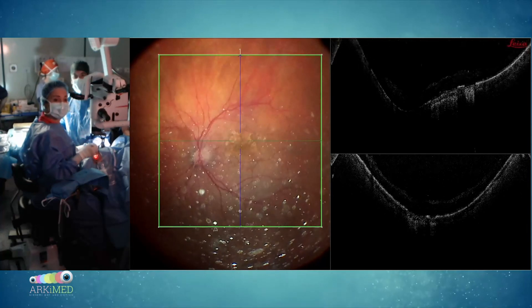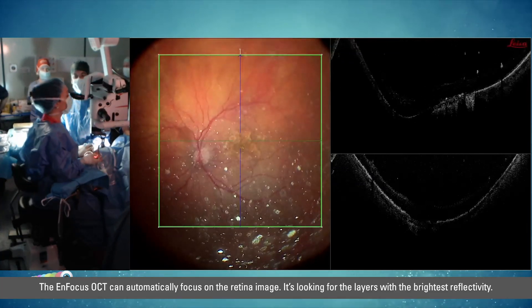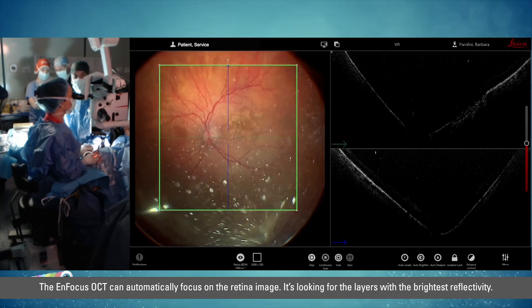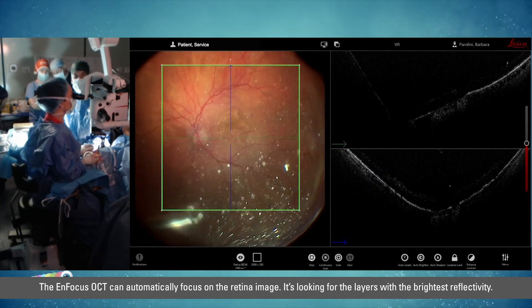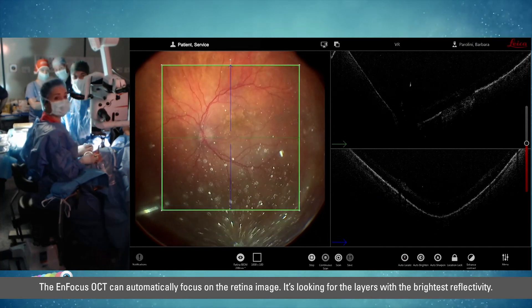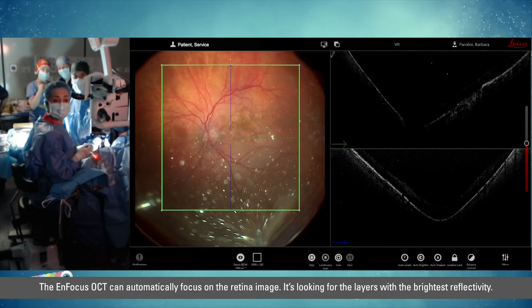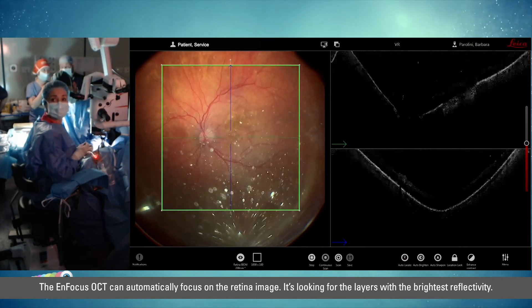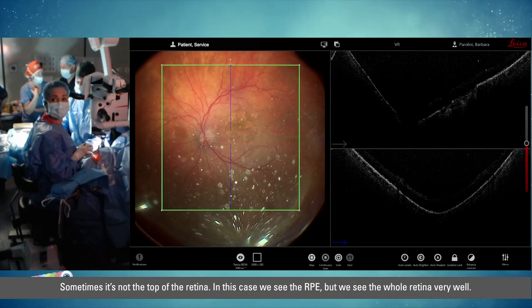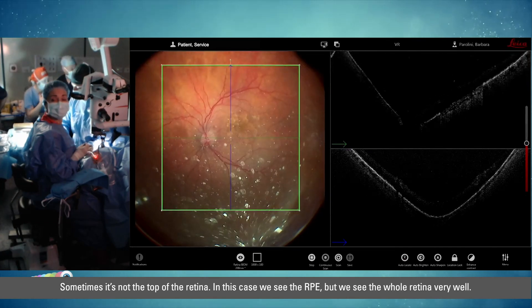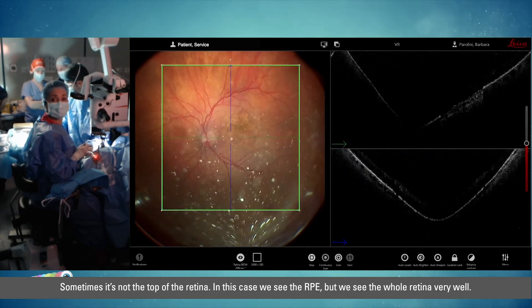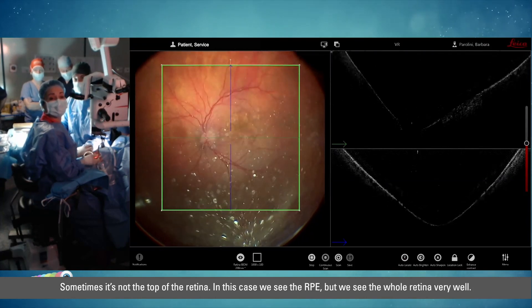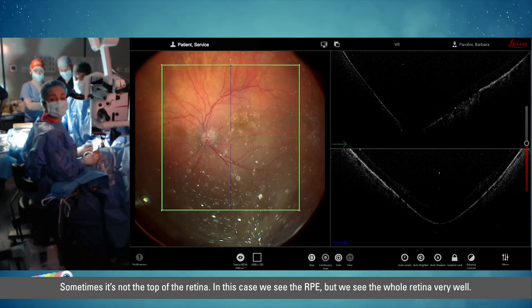The OCT has a new way to automatically focus on the retina image. It's actually looking for the layers with the brightest reflectivity, so sometimes it's not the top of the retina — in this case it appears to be the RPE — but we can see the whole retina very well.